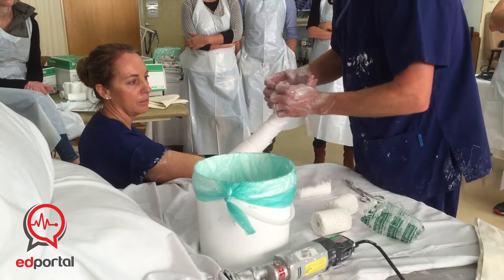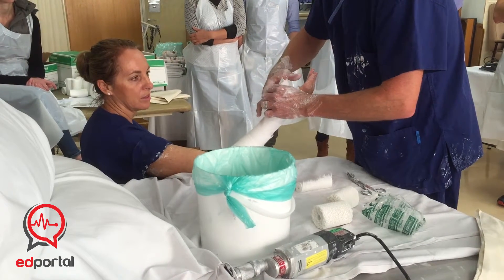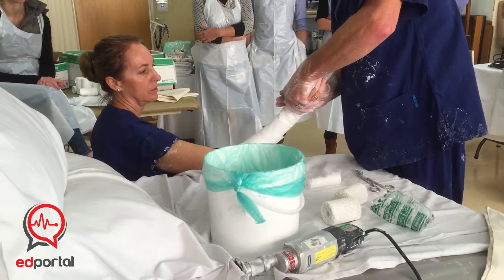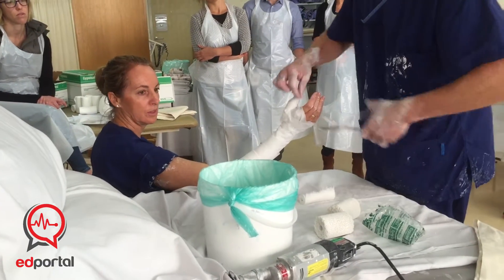I want a fairly snug fit around the thumb, but we want it as functional as possible for the person. It's important for rehab not to put their fingers out of action, so if you position the thumb wrongly and they can't grip with it, then that's just another thing you've got to work to get back.